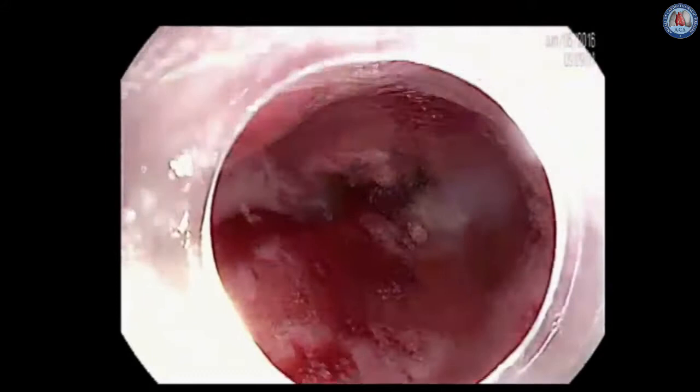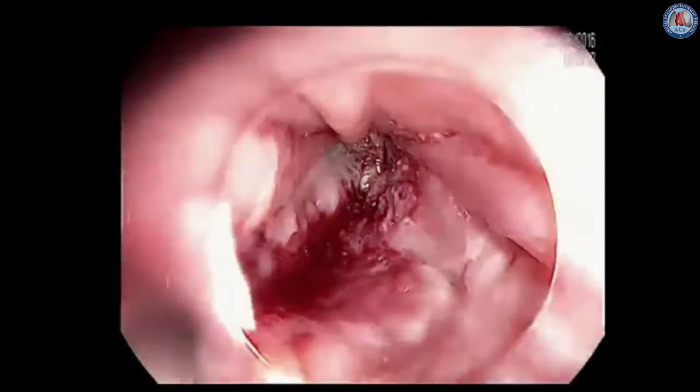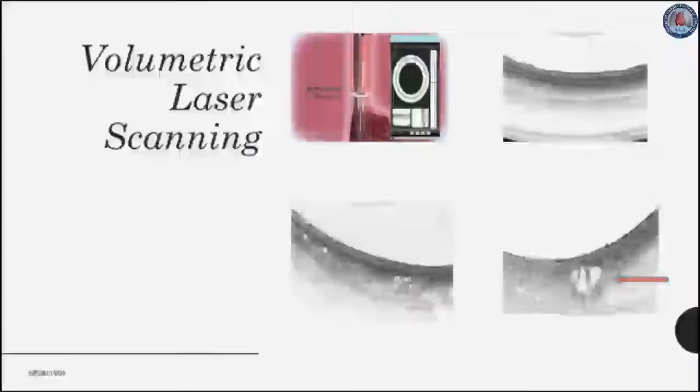This video illustrates the usefulness of endoscopic ultrasound in staging esophageal cancer. This is an esophageal cancer involving more than half of the circumference of the esophagus and causing significant narrowing. With endoscopic ultrasound examination, we find that this lesion involves all the layers of the esophagus. In addition, there are multiple lymph nodes noted, consistent with a T3N1 tumor.